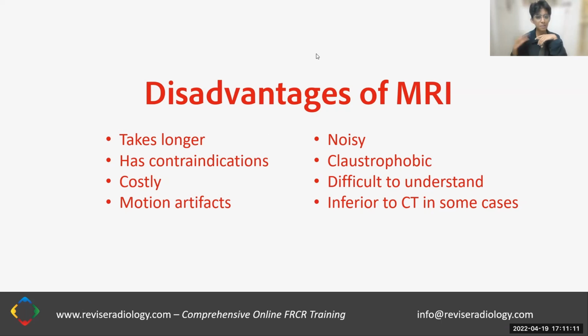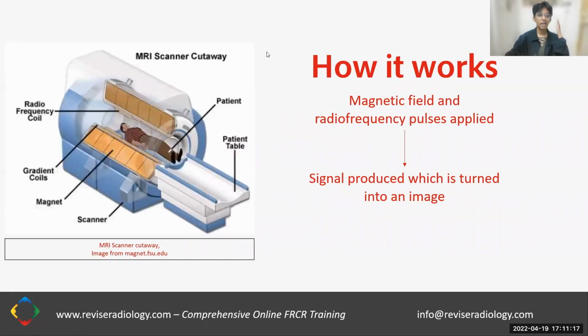And obviously, in some cases, MRI is not the ideal examination, and other types of imaging need to be used. Okay, so we've just had a brief look at why we like MRI as an imaging modality.